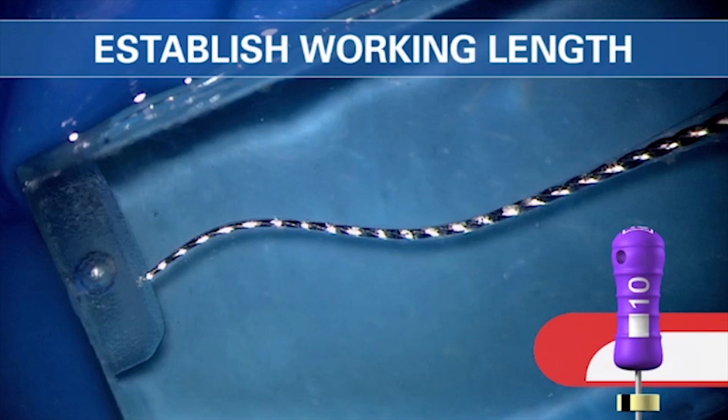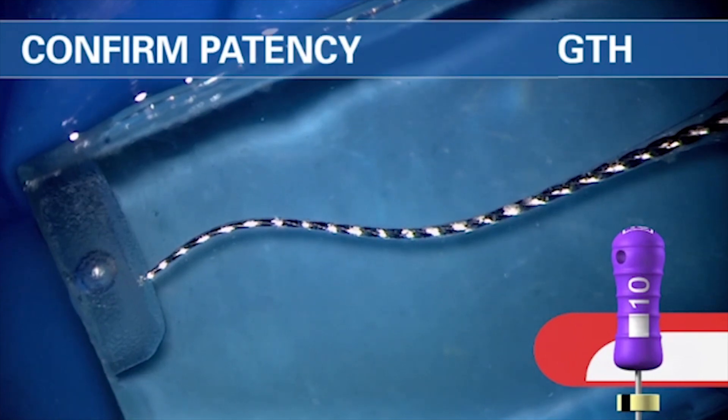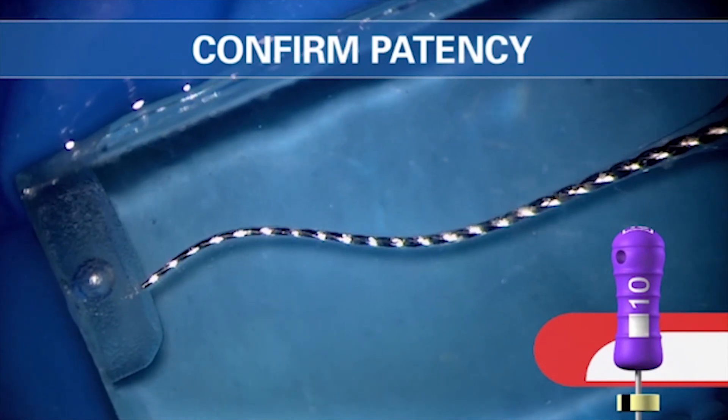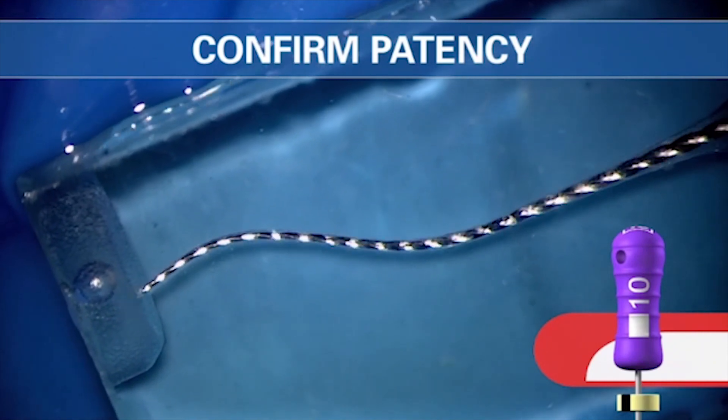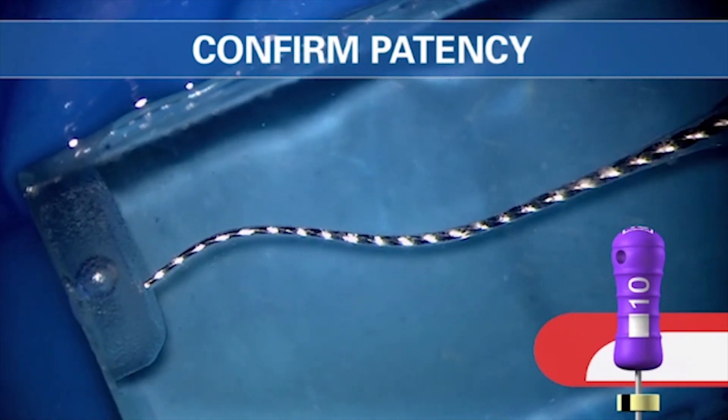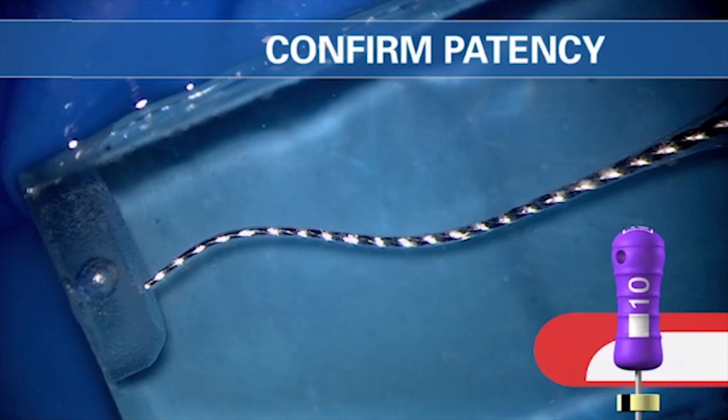This is when you would use clinically an apex locator or use a film to determine working length. With a known working length, let's establish patency. Remember the canal was patent before you ever started and it should be patent now. Move the file deliberately and intentionally to and minutely through the foramen and continue with little short half-stop amplitude pull strokes — push pull — until the file is loose. When the file is really super loose at length, the canal has been transitioned to a little greater than a size 10. The question now is: is it appropriate to use a mechanical file in this canal? Is it safe? To determine if we can use a mechanical file, we need to confirm not only patency, but then we need to verify the glide path.